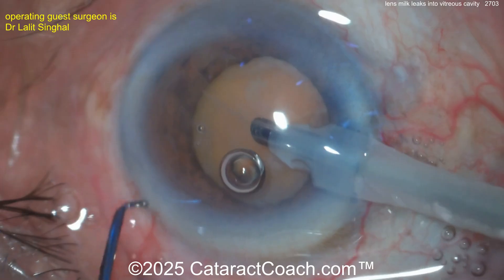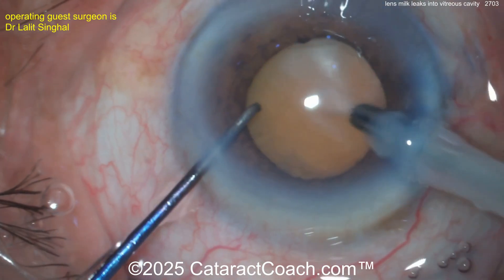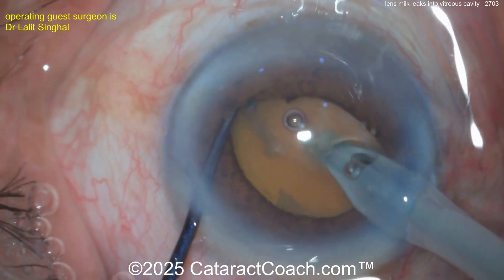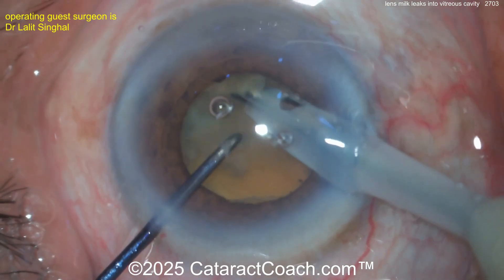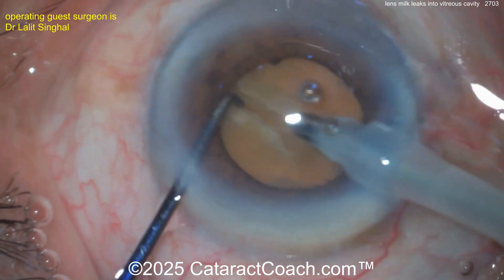More and more of this lens material — aspirate it out. Obviously a dense central nucleus there. Looks like a chopper in the left hand. Buzzing into the phaco nucleus, and there's a lot more liquefied lens cortex coming out. Surgeon going around with the chopper — looks like a nice phaco chop. It's a pretty fibrous, dense lens.